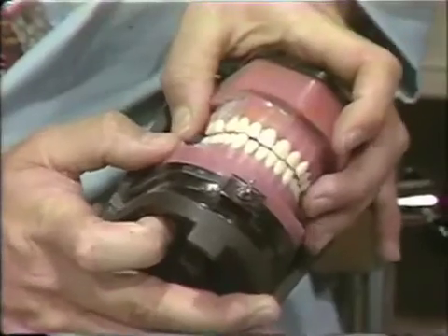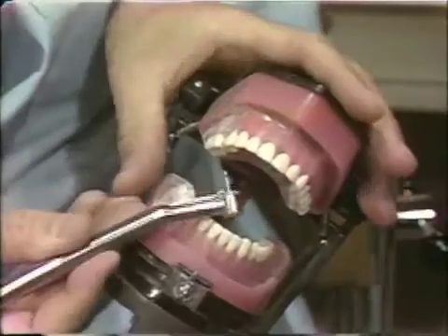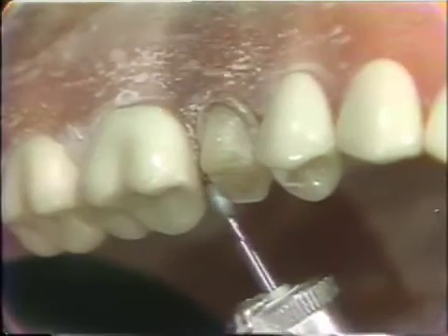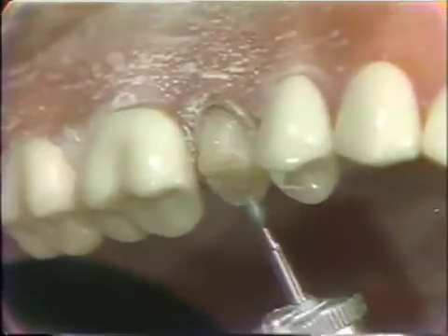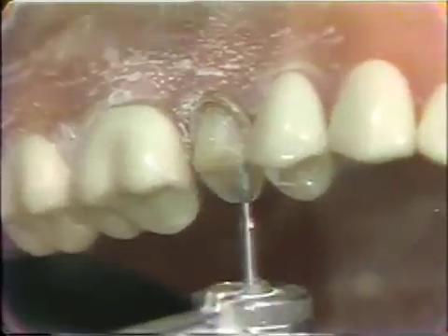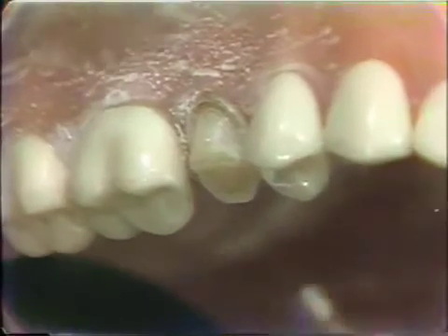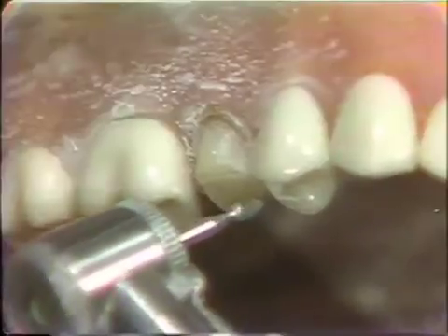It is important again to have enough reduction if you want to get good color on this occlusal surface. A little more reduction in this area. We will round these line angles with this instrument and then we will turn this around and bevel this line angle again.